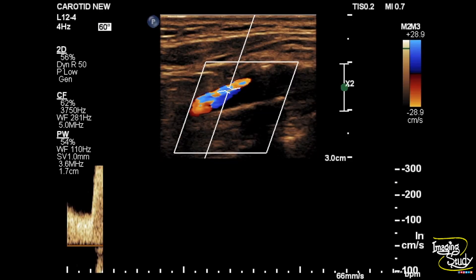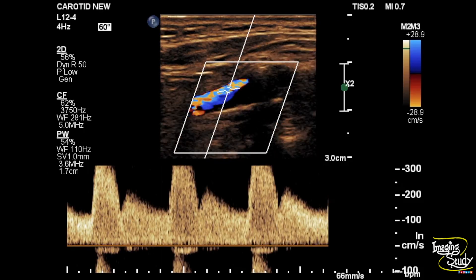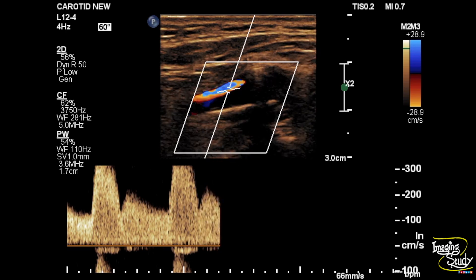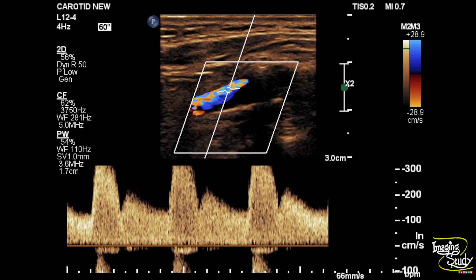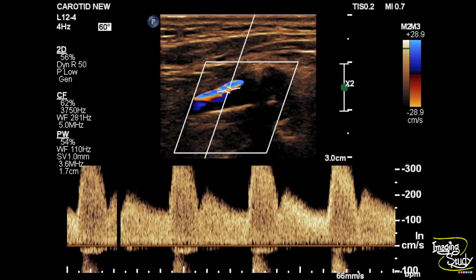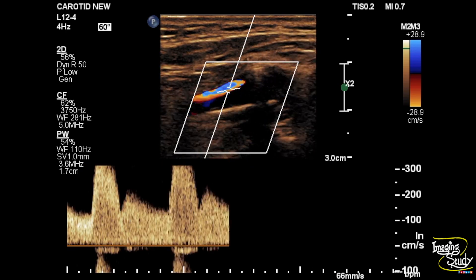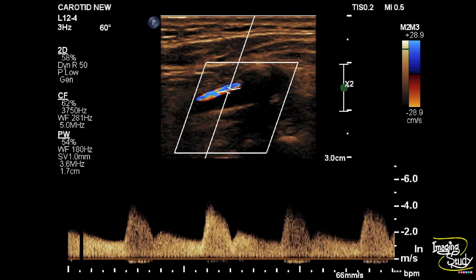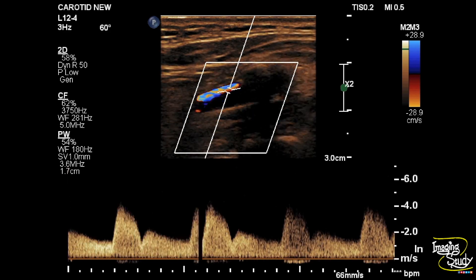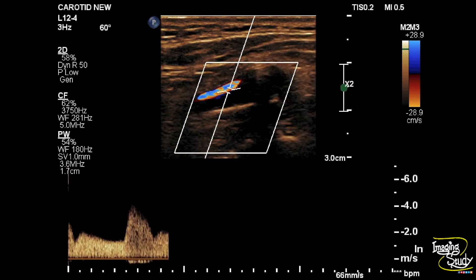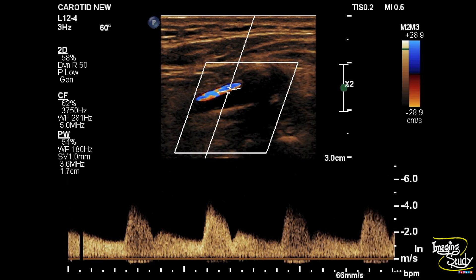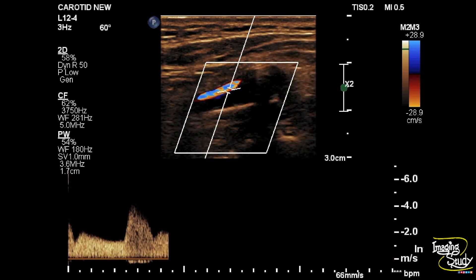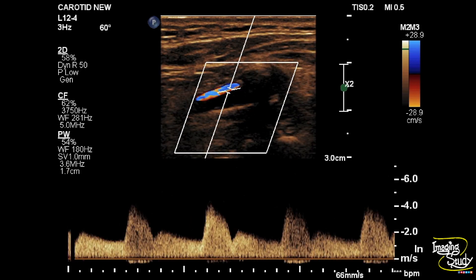Now when we apply spectral Doppler from this area, there is a huge turbulent flow and you can see the peaks are getting cut off due to high velocity flow. We have increased the scale or PRF, and you can see there is very high velocity flow here with loss of spectral window, indicating severe luminal narrowing or stenosis.